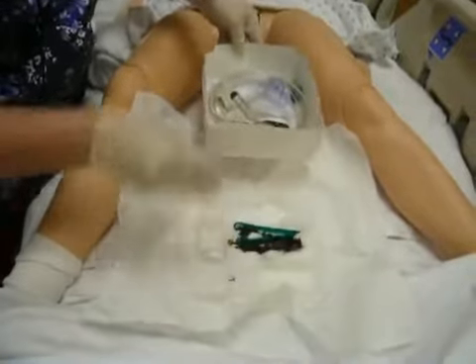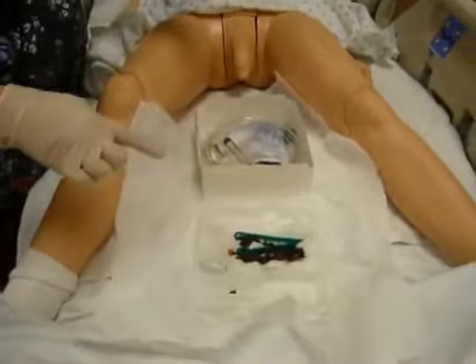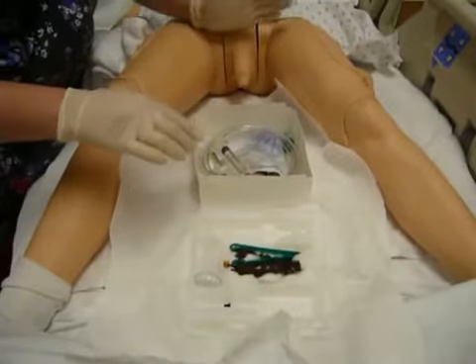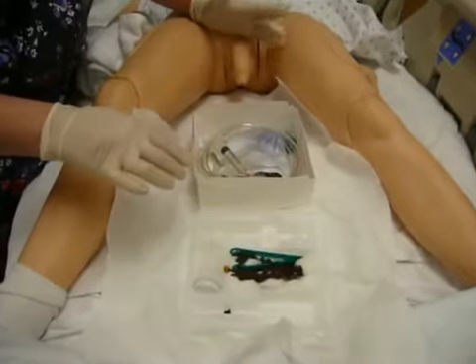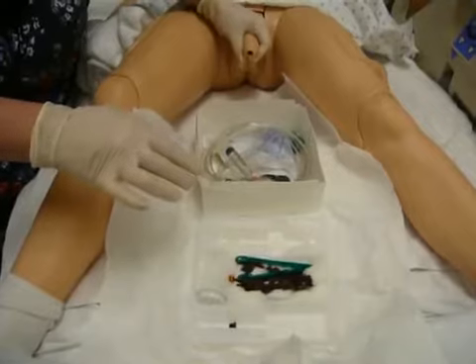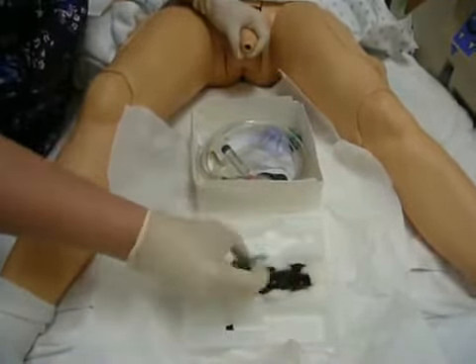You separate the two containers, and when I do my last survey to make sure everything's correct: lube, betadine, and catheter ready. Now I'm going to contaminate my hand by putting my hand on his symphysis pubis. I'm going to wrap my fingers around his penis, starting with my pinky finger, working up to my thumb and index finger, making sure that I have good control of it.